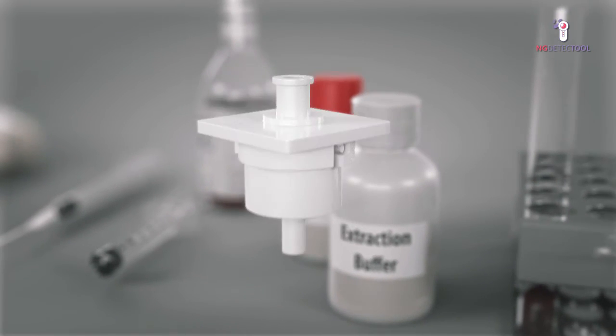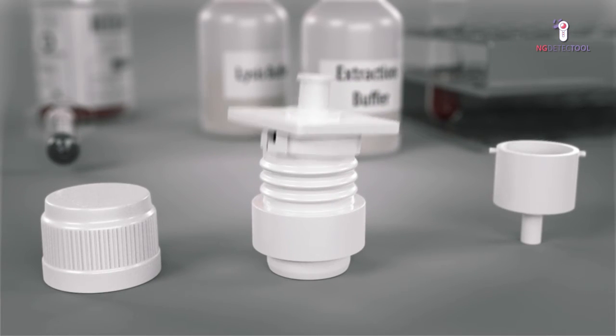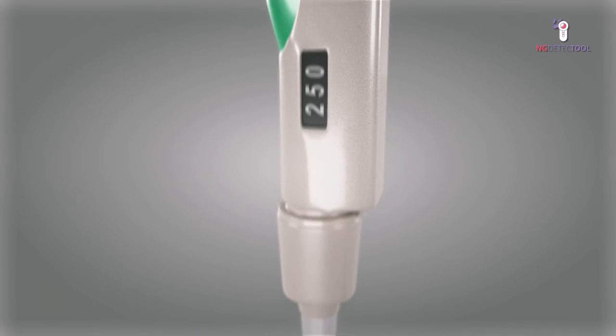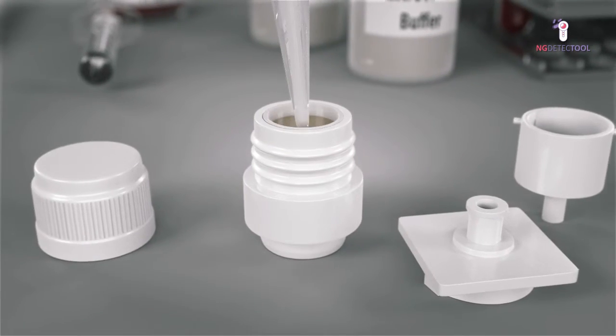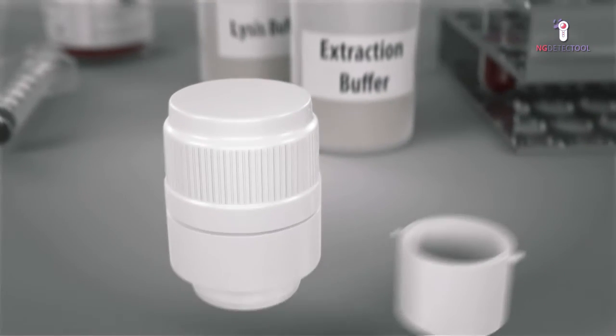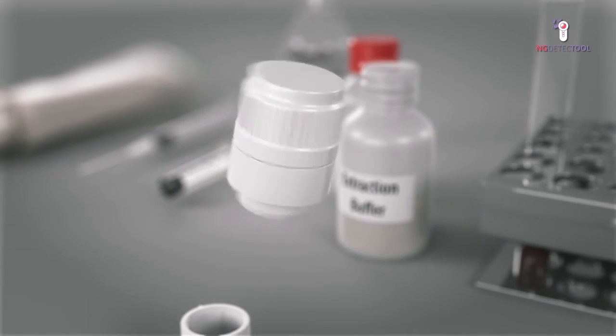Once the sample has passed through the filter, unscrew the lower part of the device. Transfer the filter into the tank and remove the upper part. Then add 250 microliters of the extraction buffer to the cup and screw on the cap. This pushes the extract through the filter into the tank where the dried conjugate is located. Shake slightly to dissolve the conjugate.